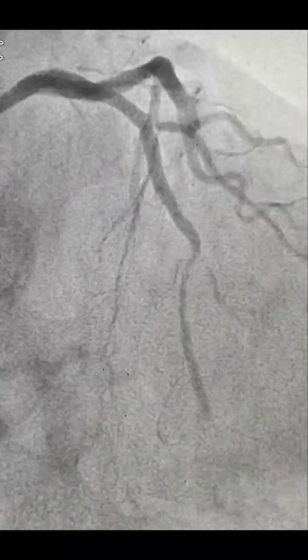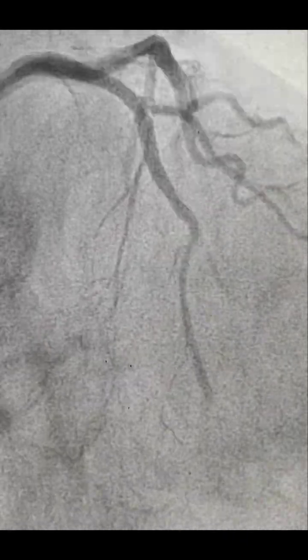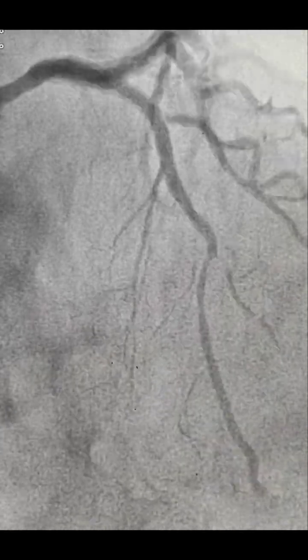So this was a difficult primary angioplasty in this old man, with no flow, slow flow after angioplasty. Now TIMI 3 flow was achieved with all treatment, and now the patient is on GP2B3A inhibitor, tirofiban, and nicorandil. And now he was good at this point and then shifted to ICU. The patient is doing well now. Thank you.